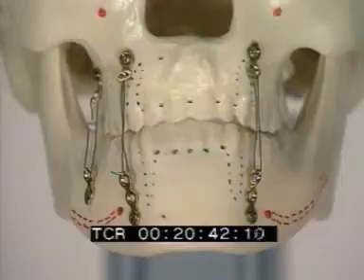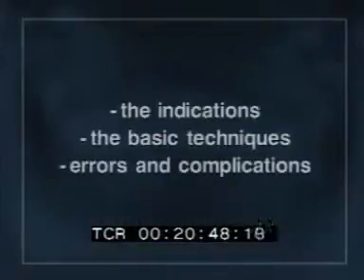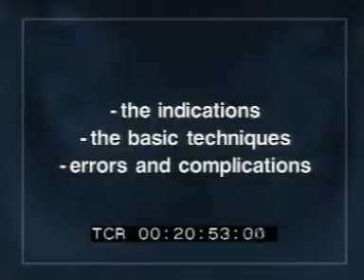Bone-supported devices need precise planning because of the risk that they may damage adjacent tissues. This survey of mandibulomaxillary fixation procedures has shown the indications, the basic techniques, and the errors and complications of the methods used in dentate patients.